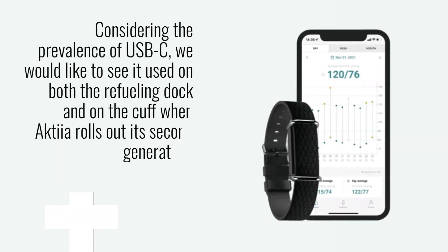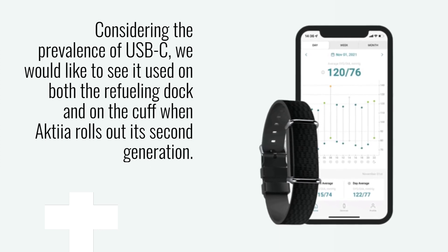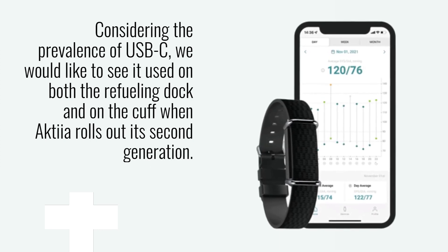Considering the prevalence of USB-C, we would like to see it used on both the refueling dock and on the cuff when Aktiia rolls out its second generation.